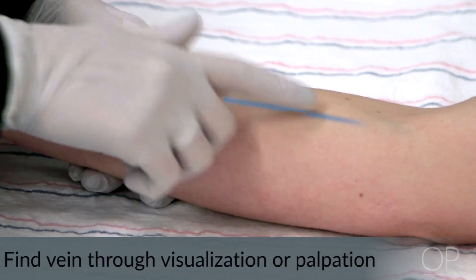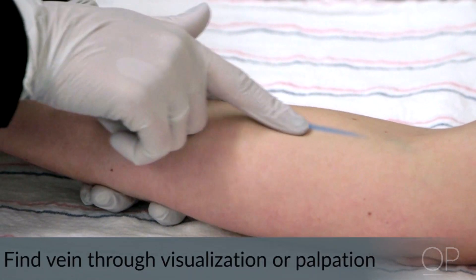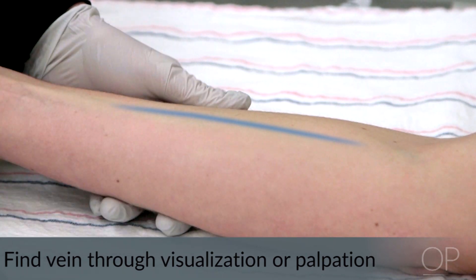First, you will need to find the vein. You should visualize for the vein or you can palpate and feel a bouncy tube. Sometimes you will need to place the tourniquet as your first step to help find the veins and fill them with blood to make it easier to visualize.